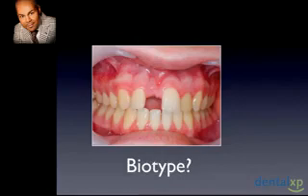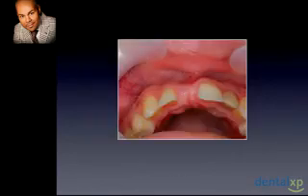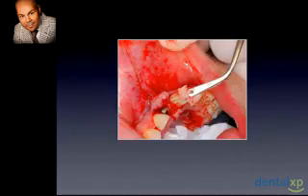We have movement of the midline frenum, and we evaluate to see if we have adequate bone to place the implant at the same time. In this instance, you see the buccal defect with loss of volume. So we went ahead and placed the implant, and initially I would go ahead and place a connective tissue graft at the same time in addition to a bone graft over top of this.